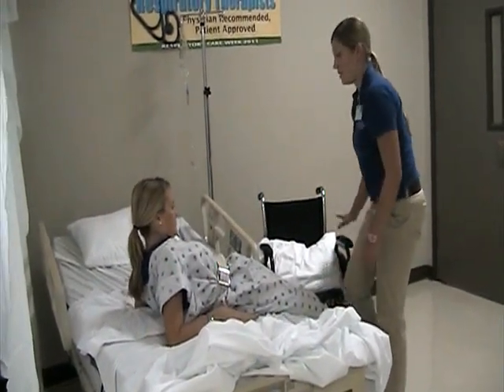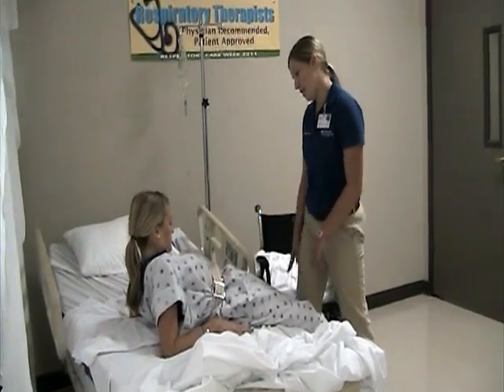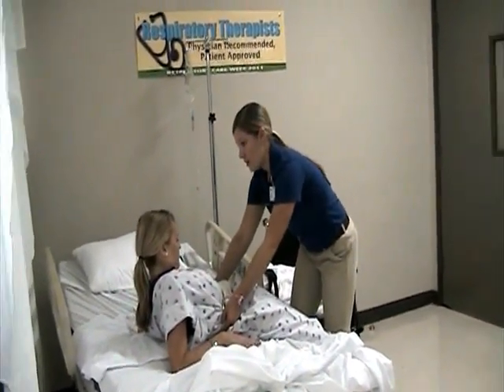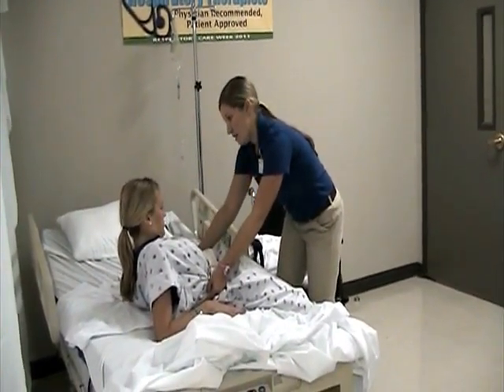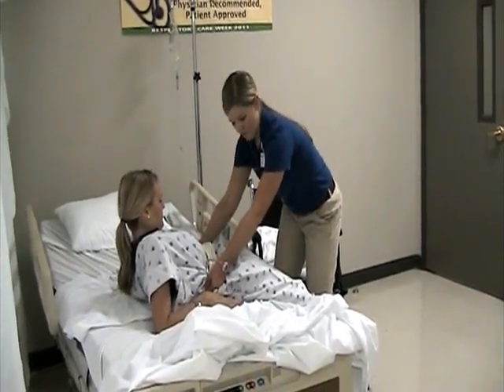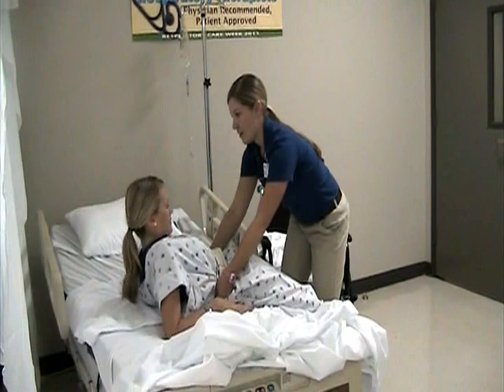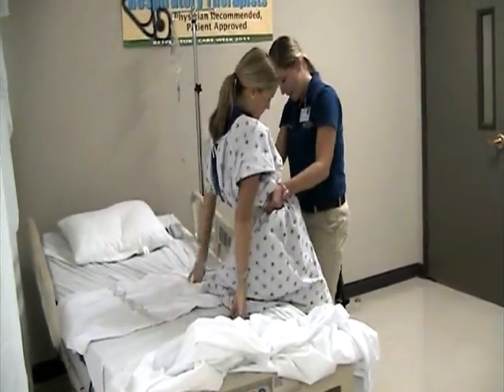Now the next thing we're going to do is be sitting in the wheelchair. We don't want to lean that body forward too much, okay? Remember that 90-degree angle we want to avoid. So what I'm going to do is I'm going to come here. I'm going to get you to press with your elbows and your hands, your left foot, and then your right foot as much as you can without any pain occurring, okay? So we're going to weight bear as tolerated on that right foot. All right, so are you ready? Yes, ma'am. Okay. So on 3, remember to stay leaning back, okay? 1, 2, 3. Come up, stay back, good.